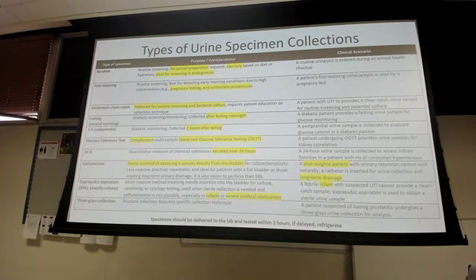Have a little bit of urine go into the commode, and then you want to go ahead and collect that specimen. The reason for that is because you don't want to get those skin cells into that urine. That could be possible contamination, and we wouldn't be able to send it to micro for culture studies, okay? So, again, another very good slide that you all need to know.